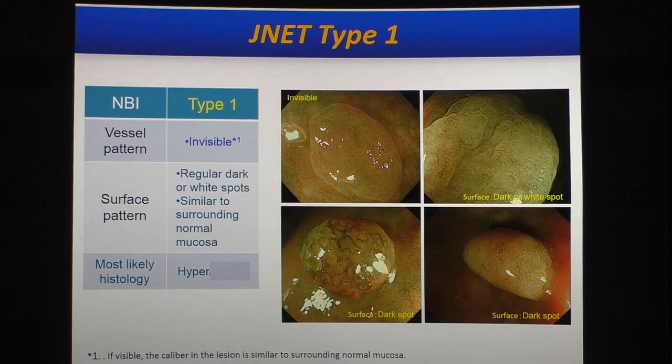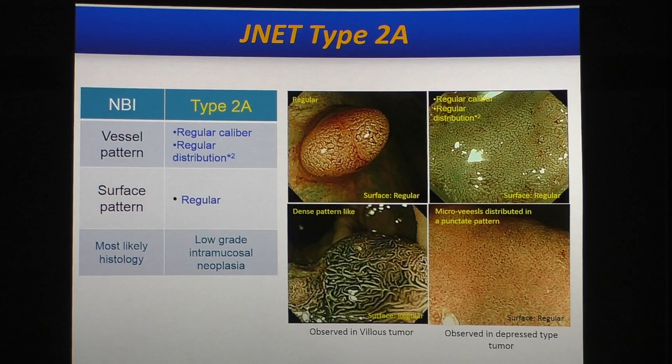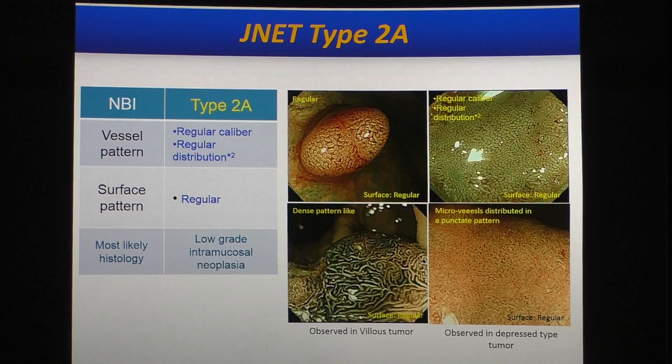What about type 2A? Type 2A is most often observed in daily practice. In the vessel pattern, regularly lining vessels surrounding the normal pit structure are observed. In that case, this lesion is classified as JNET type 2A, which usually indicates tubular adenoma or low-grade intramucosal neoplasia.